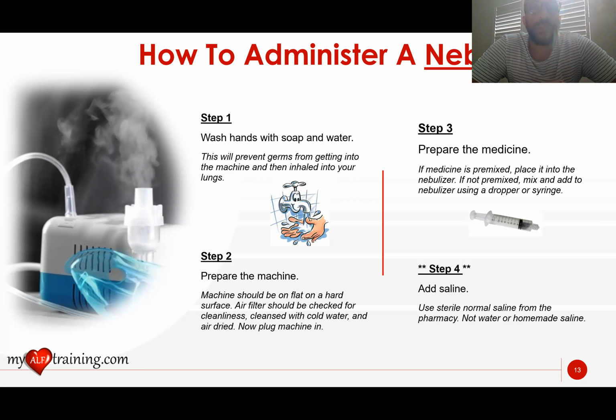Because if you saw in the video and also in my demonstration, when I filled our medicine chamber here with medication, our fingers touch directly in that chamber and touch the medication directly. So we want to make sure that our hands are clean. Why? Because this medication is inhaled directly into the lungs.